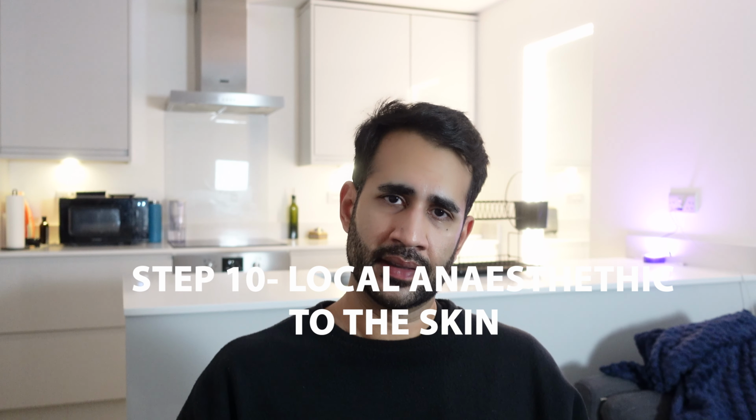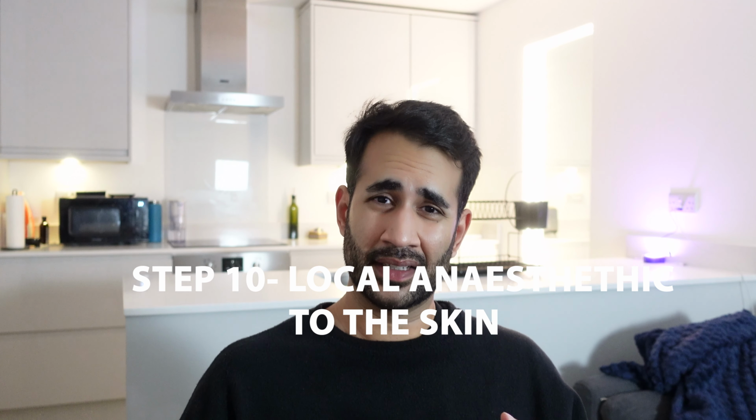And then usually there'll be a little bit of local anesthetic that will go into the skin. Now this usually is quite stingy. People are generally surprised if you haven't had local anesthetic before. It does sting quite a bit as it numbs up under the skin, but that's usually quite quick as well, and then it will numb up quite nicely. And then after that, as the next needle goes in, usually you only feel more of a pressure and pushing kind of sensation rather than any sharp pointing or poking sensations.